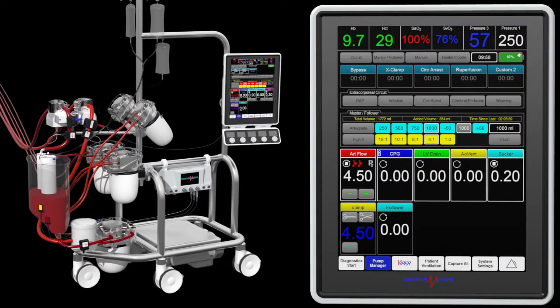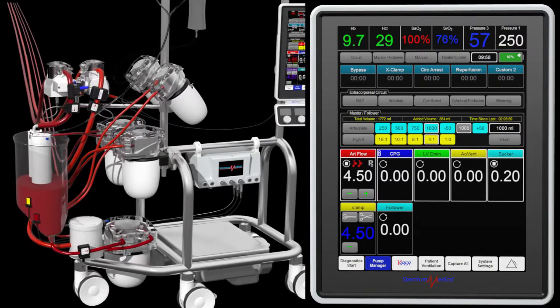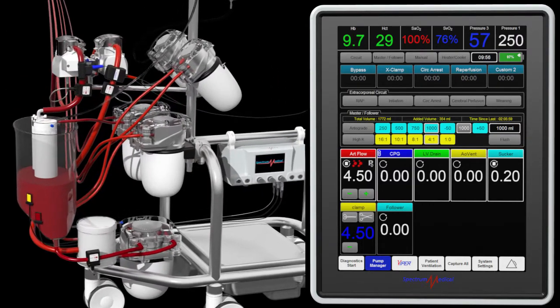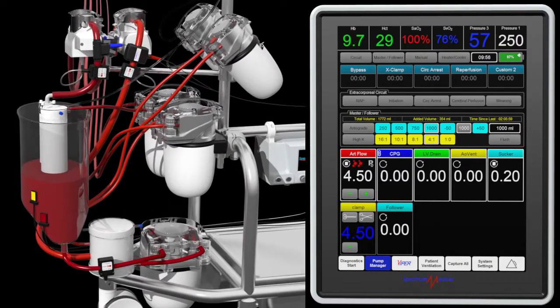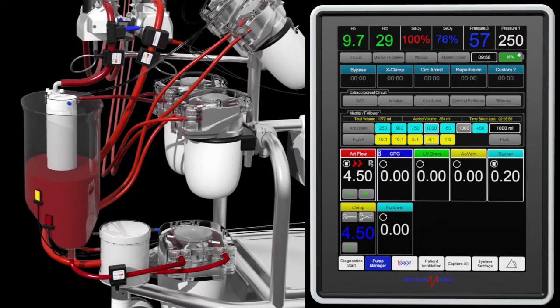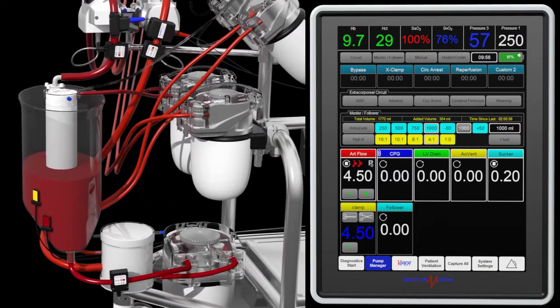Note the red and yellow venous reservoir level sensors. If fluid level drops to the red sensor, the arterial pump stops.